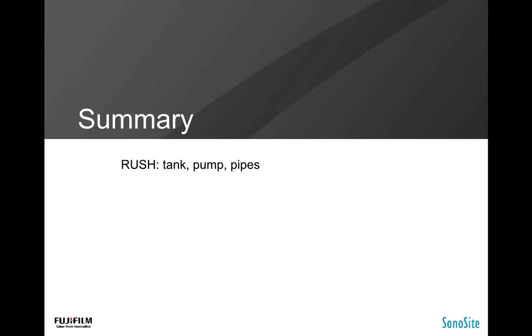The RUSH exam is a collection of core exams that many critical care and emergency physicians are already performing. Research has shown that applying a resuscitation protocol improves accurate diagnosis in undifferentiated shock. One study compared treatment plans, presumed cause of vital sign abnormality, and the degree of certainty in the cause of shock, both before and after ultrasound findings. Treatment plans were changed in more than half of the cases. This suggests that accurately diagnosing a patient's shock state using ultrasound may translate into better outcomes for our patients.